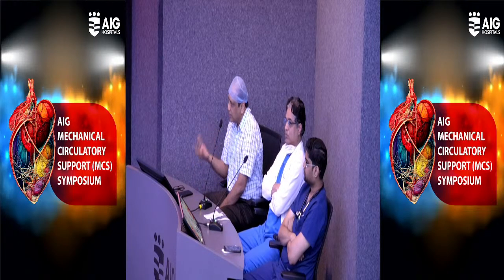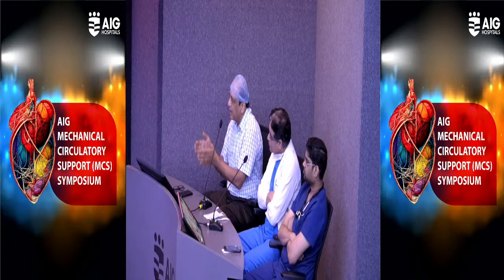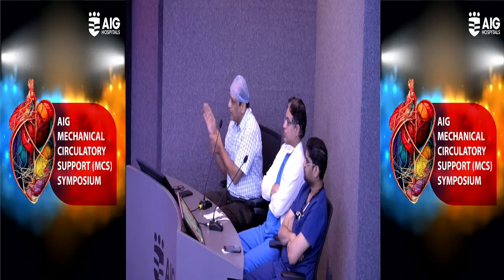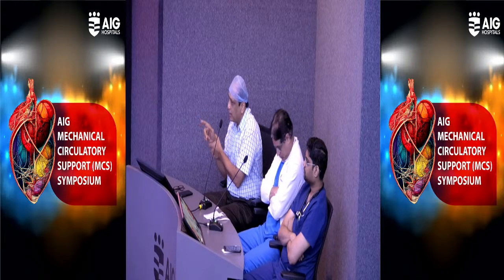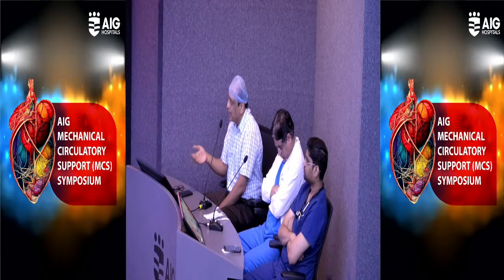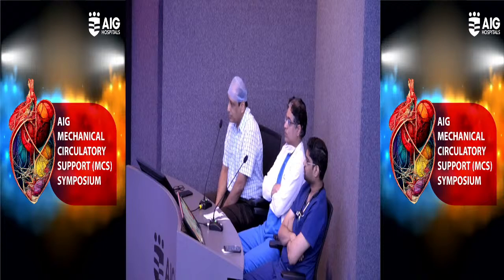So to test the heart which is being developed, we are implanting a regular TandemHeart type of device in animals. Recently, 2 weeks back, we went and Naresh opened the chest. He put a cannula in the left atrium and left a cannula in the descending thoracic aorta. We closed the chest and the sheep got extubated and it survived. We kept it alive for 48 hours and after that we killed the sheep. So TandemHeart is excellent and I think it has got a bright future.